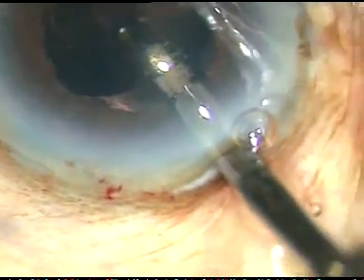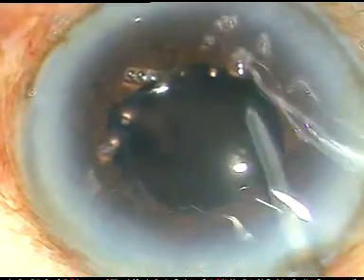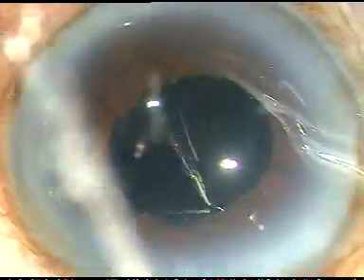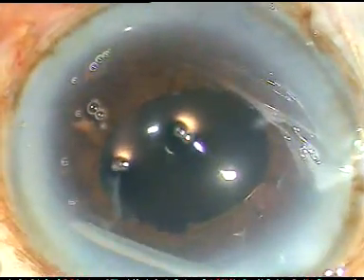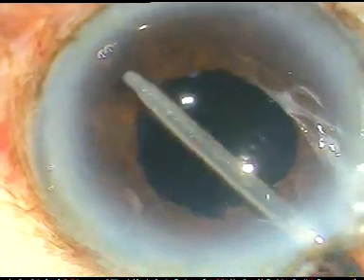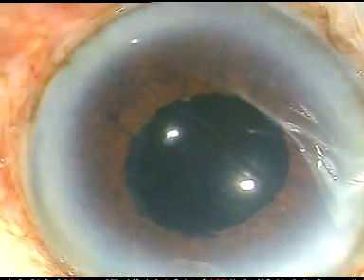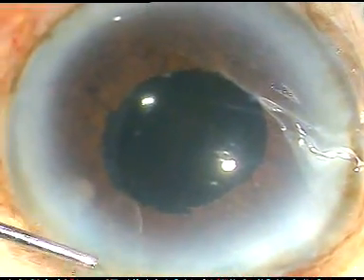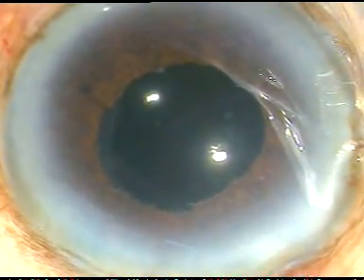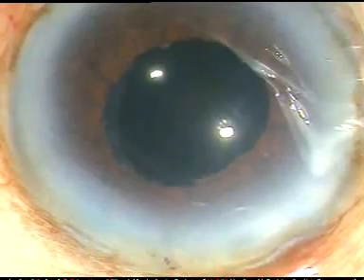Now I am irrigating out the viscoelastic substance from the anterior chamber and from the capsular bag. Using the irrigating probe of the bimanual I/A for removal of viscoelastic substance, I sweep around the angle. When the viscoelastic substance is nicely cleaned, I just hydrate the side port used for the chopper. These stab incisions don't need any hydration. Now I go to higher magnification and make a final wash.